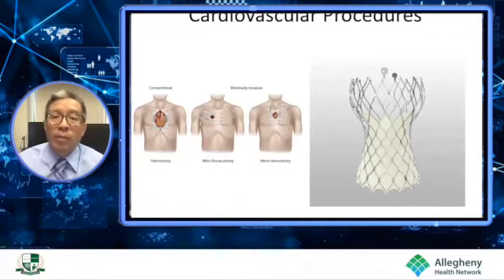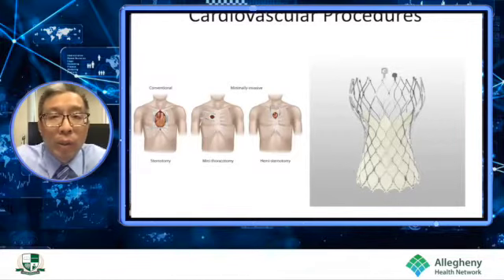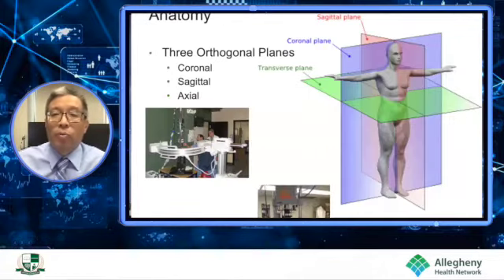Cardiovascular is another application that has benefited directly from imaging improvements. The technology associated with imaging, the navigation technology, and now the robot-assisted technology certainly has benefited and has been applied in areas like cardiovascular application. When we see what they do with heart valves, stent placement, and all these other robot-assisted procedures that have been introduced into the cardiovascular space, it is very encouraging to see that technology has certainly capitalized on the skills of the surgeon and also added, when we look at patient performance, added benefit from these robot-assisted procedures.